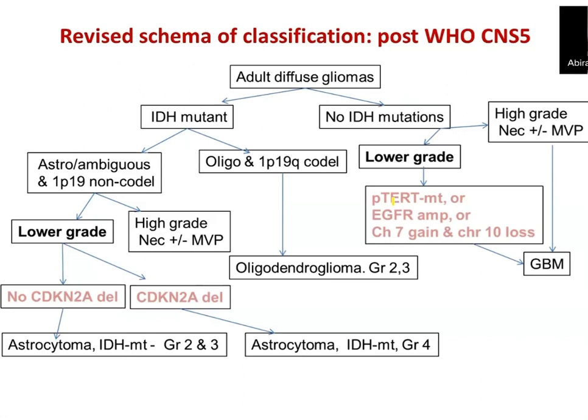IDH is negative. Yes, she is saying that IDH is negative by sequencing as well. Has that been done for IDH2 mutation also, or only IDH1? If both sequencing IDH1 and 2 are negative, you don't go into the ATRX. It becomes an IDH wild type tumor.